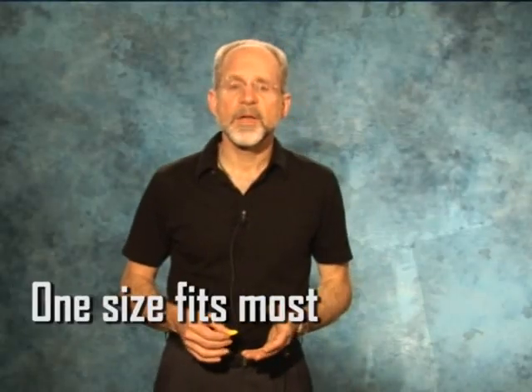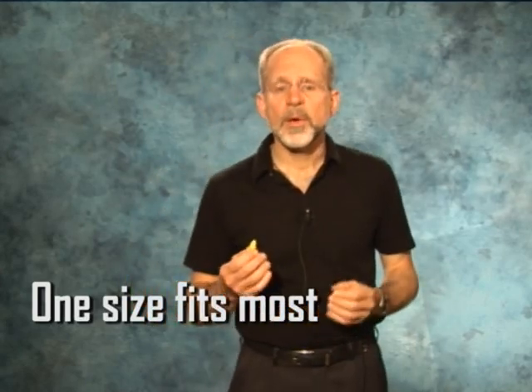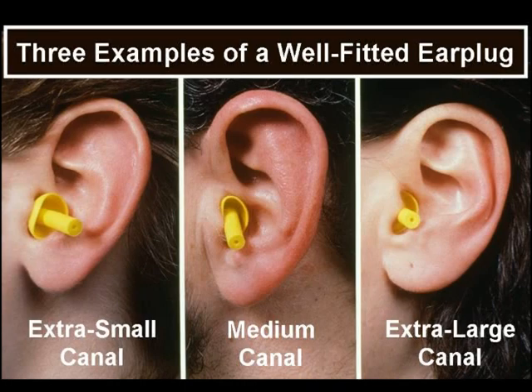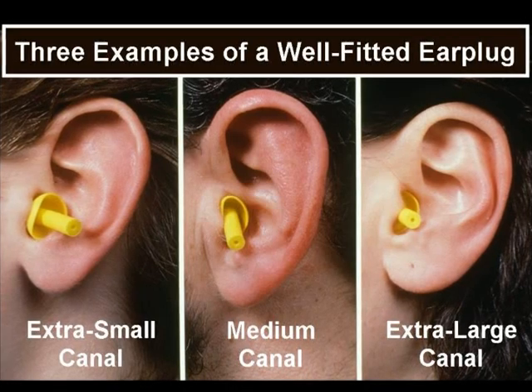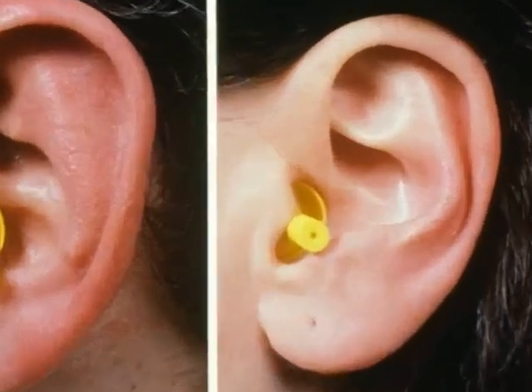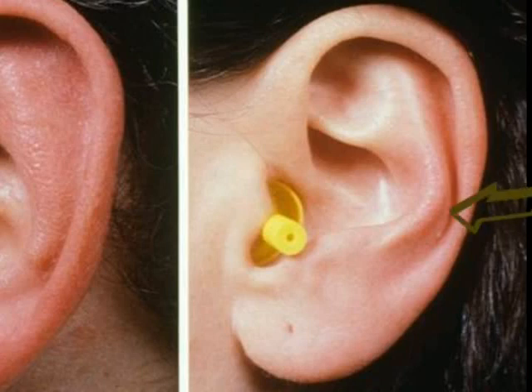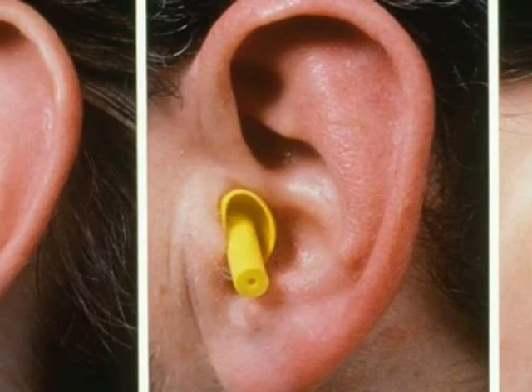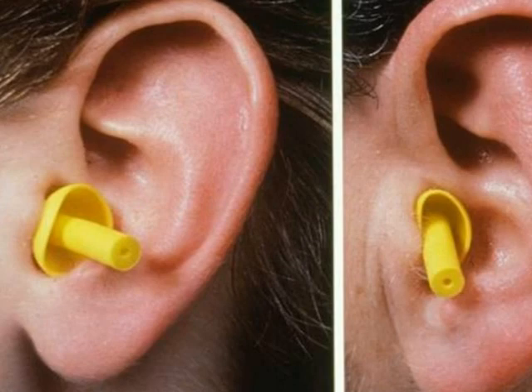Since the UltraFit plug is a one-size product, it will fit differently in ear canals of different sizes. That is shown here for extra small, medium, and extra large ear canals. Note how in the extra large ear canal, the trailing edge of the last flange of the earplug is about flush with the entrance of the ear canal. However, for the canals that get smaller and smaller, more and more of the flanges will be exposed.